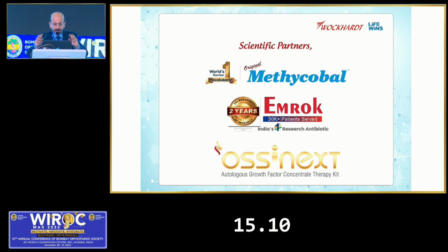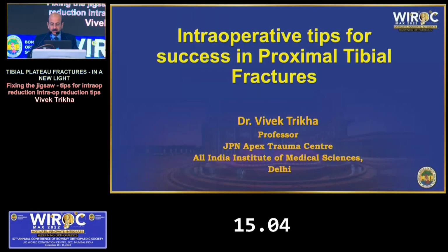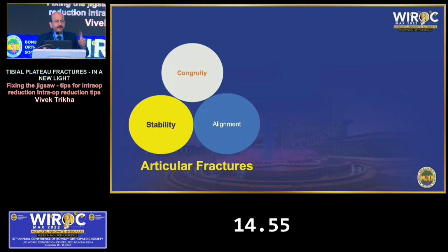Thank you, sir. And I'll be speaking regarding the intra-op tips for success, which most of our previous speakers have already covered. I'll just give you 4 or 5 tips, which I felt will be slightly different from what we know of usually. The first tip is articular fractures depends upon congruity, stability, and alignment.